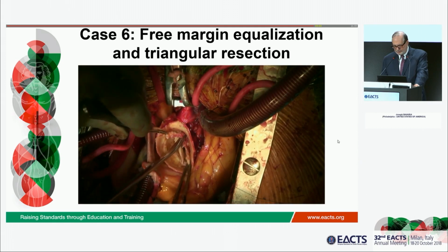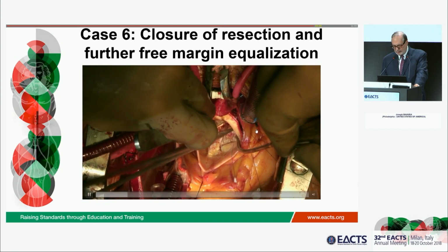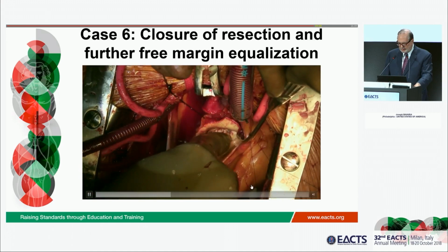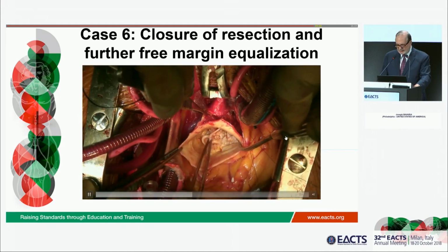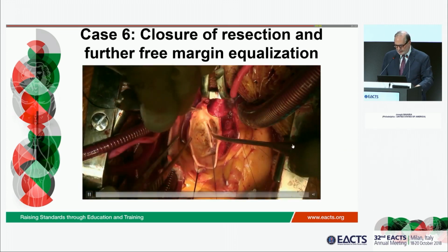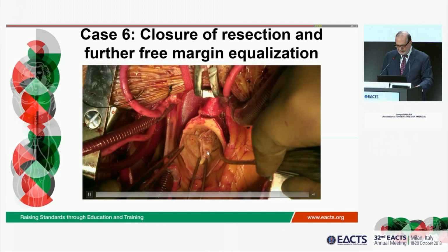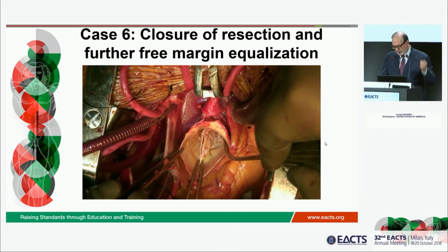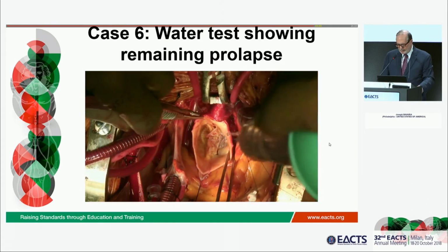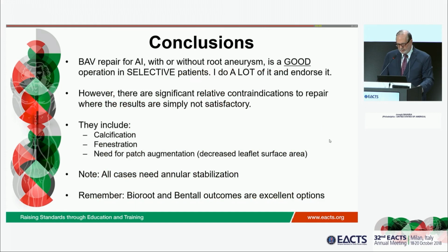We do that. We put these stitches in. It's almost the entire length. I finished the case, and I'm just looking at this, and I don't really like it. I would like to see what maybe Laurent would have done with this, but I decided that he's 71. I didn't think, here's a piece of calcium here. Even though we tried very hard to save this valve, I decided to abort. We decided not to do this case and put in a regular aortic valve.